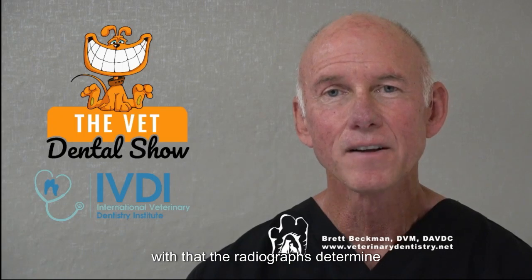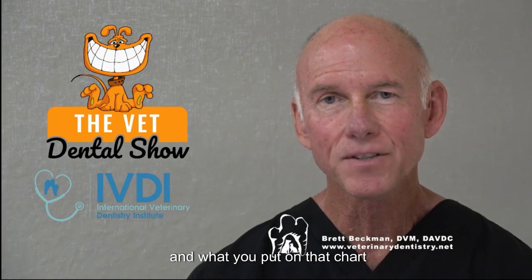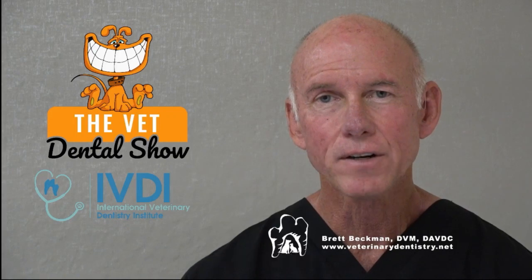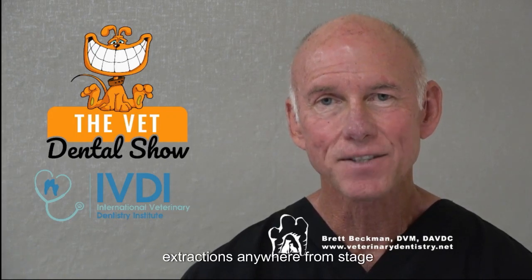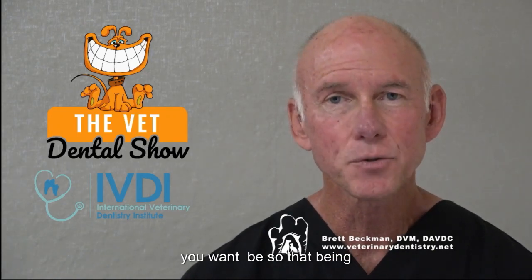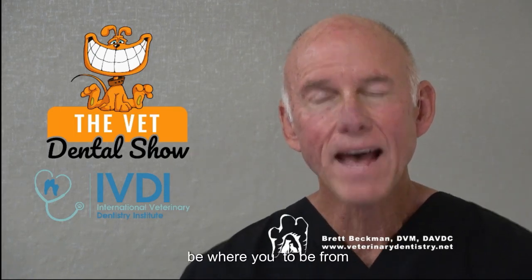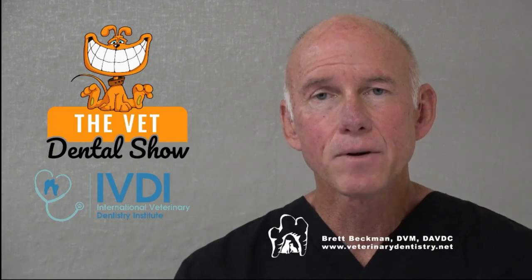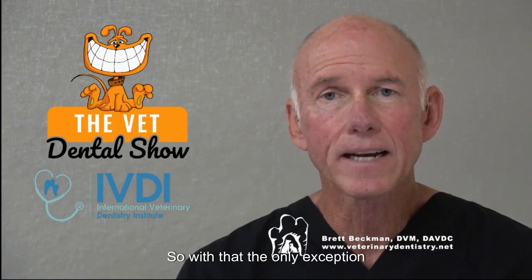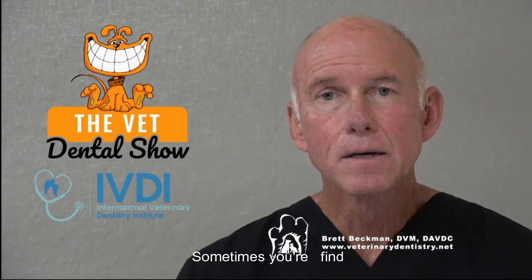So with that, the radiographs determine the stage of periodontal disease and what you put on that chart, the periodontal index or stage of periodontal disease. And that's what indicates your extractions. Anywhere from stage 2 to stage 4 is where you want to be. So that being said, and when I say where you want to be from an extraction standpoint and from a charting standpoint.